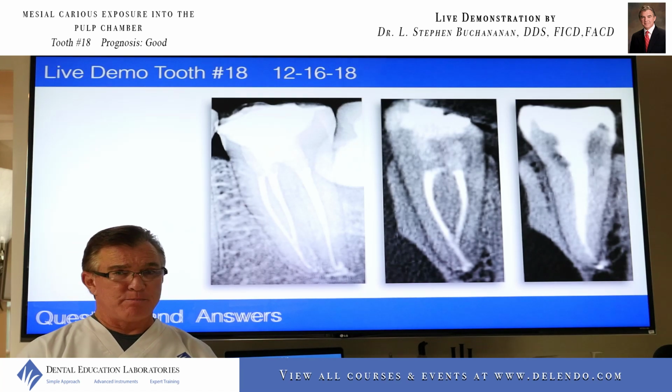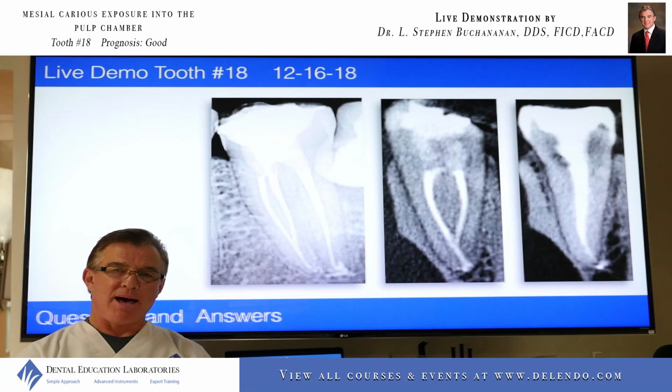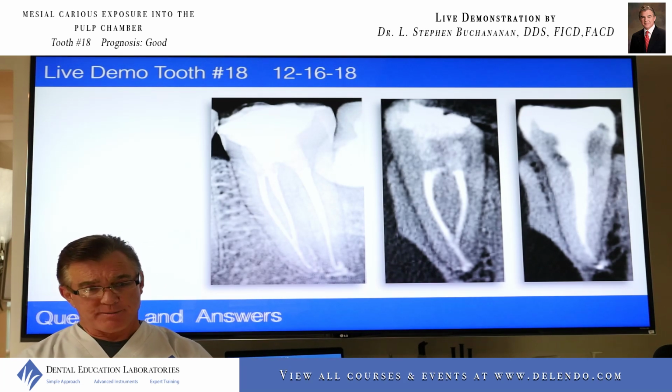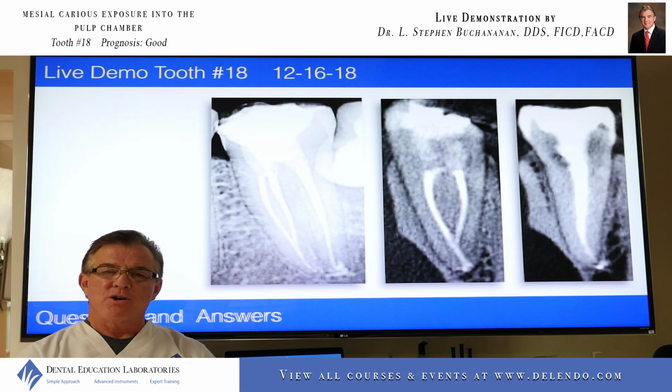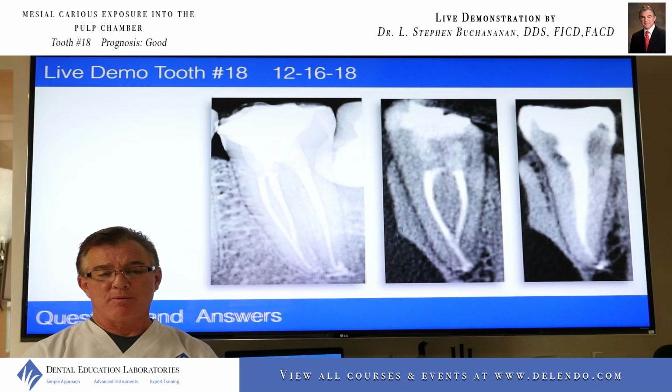It tends to be less toxic in terms of biocompatibility than, say, AH+. It's the most toxic until it sets. And so if I did get it into the canal, it would be less damaging than almost any of the other sealers that could happen with.